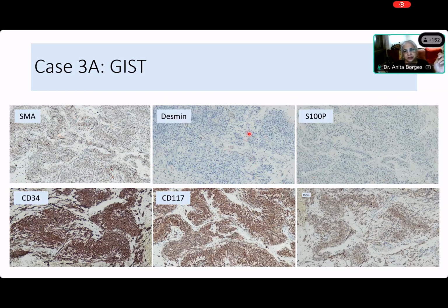Okay, tell me about desmin. Negative. And S100 protein? That is also negative. All right. And what is positive? CD34, CD117, and DOG1 are positive. All right, so what is CD117? Ma'am, C-kit only. Yes, it is essentially the CD name for C-kit.